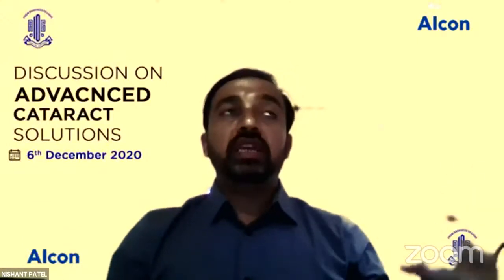So we start talking about it: you have an IOL which is monofocal, you have an IOL which is toric, and you have an IOL which is multifocal, or bifocal and trifocal with EDOF. So we give all three options. There are some PowerPoint presentations with them where they show the advantages, disadvantages, as well as the nighttime photic phenomenon pictures.